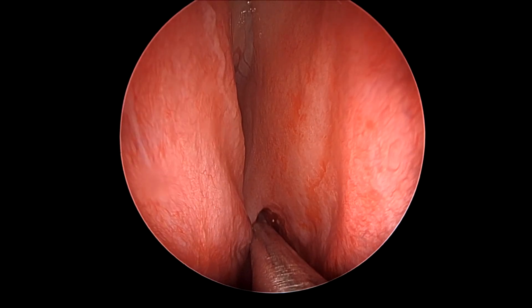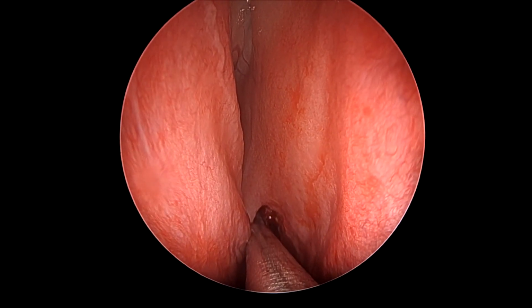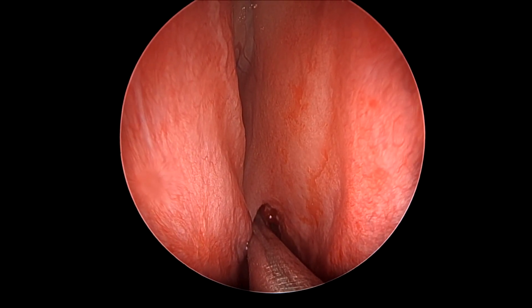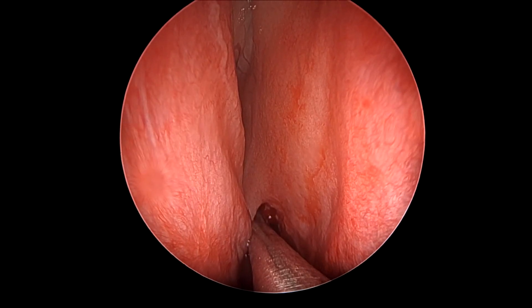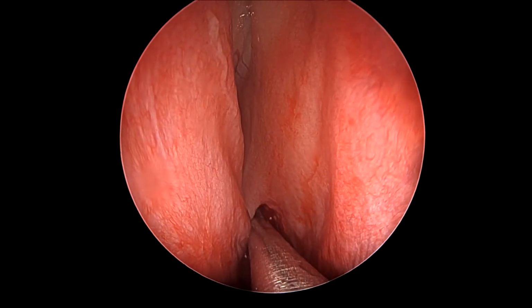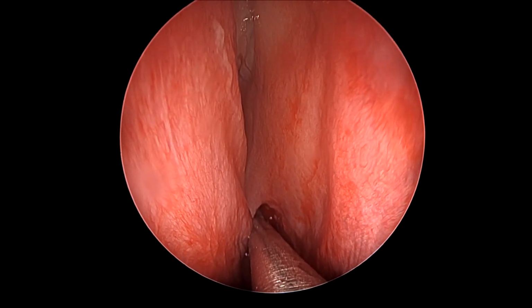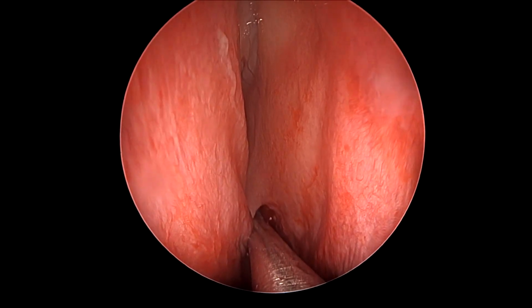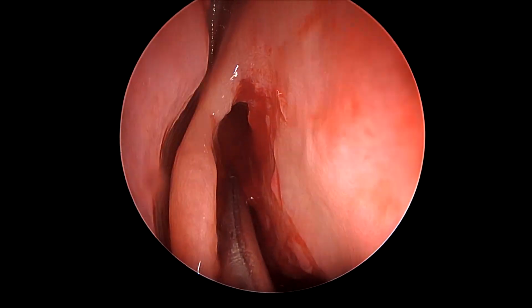Inside this complex anatomy, the navigation probe is a lot of help in identifying the exact cell that you are in, because the height of the frontal bulla cell is similar to the height of the frontal sinus, so often blind instrumentation would not be able to identify if you are really in the frontal sinus per se or the frontal bulla cell. Also, when these kinds of cells or altered anatomy are encountered, one must increase the exposure overall inferiorly to be able to access all these cells comfortably.